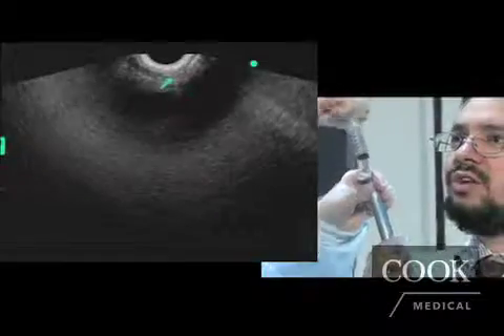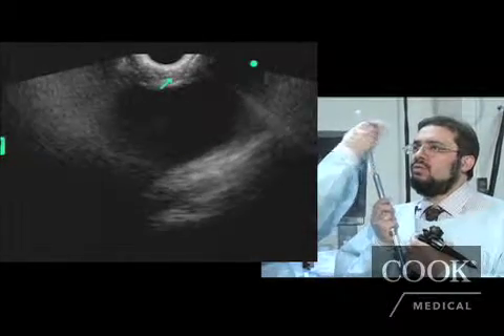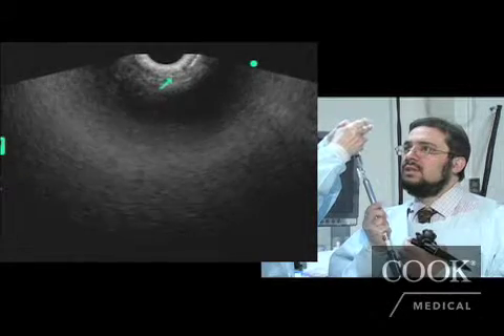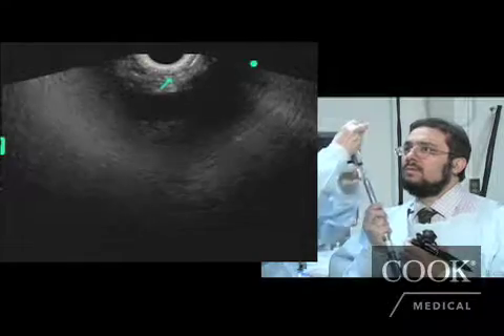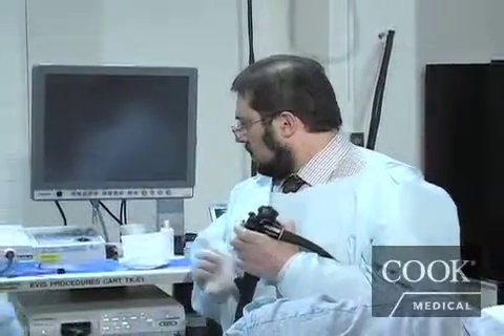As you see, the injection is really quick with this fenestrated needle. We use bupivacaine 0.25%, 6 cc's, and we injected 20 cc's of absolute alcohol in this area. We then withdraw the needle from the scope, and at this time the procedure is terminated.